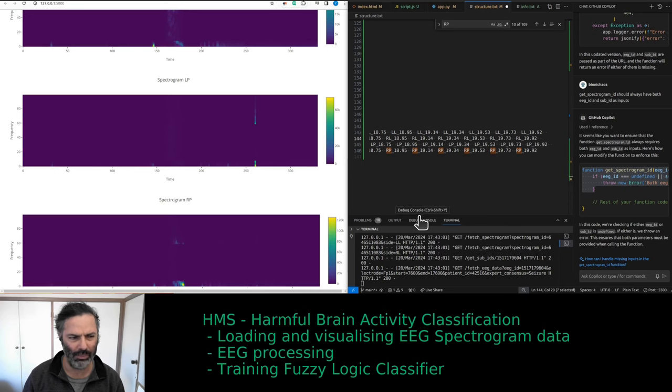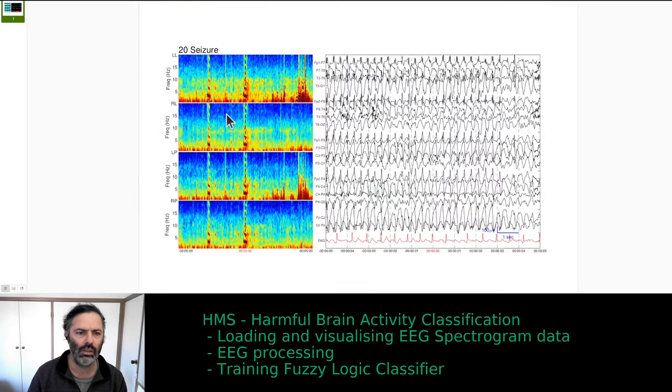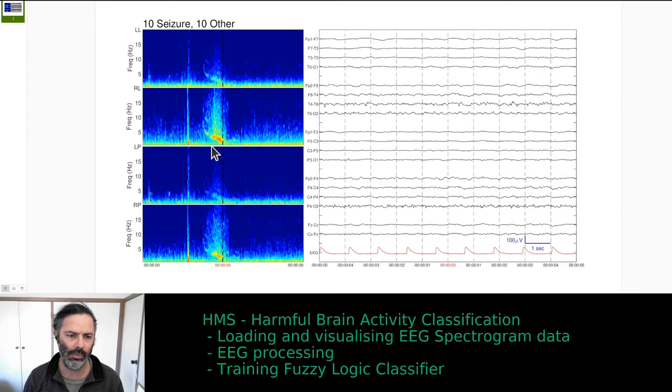We should have those frequencies going up to essentially 20 hertz. It's a bit odd. Frequency in hertz, so it is going up to 20 hertz. It's a bit low. Normally, EEG is being reviewed. Something missing, is it cut off? No, this seems to be correct. It's only going up to 20 hertz. It's really odd. But what's the sampling rate of this dataset? I keep discovering more and more weird things about this dataset. You would expect it to go at least to like 50 hertz or so.